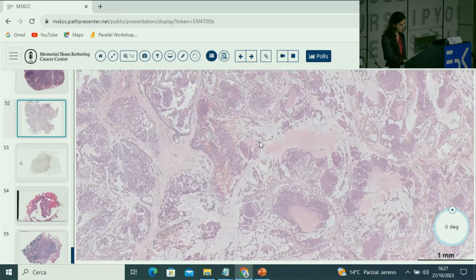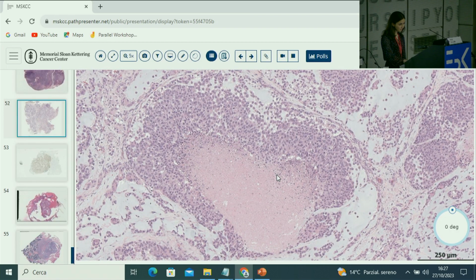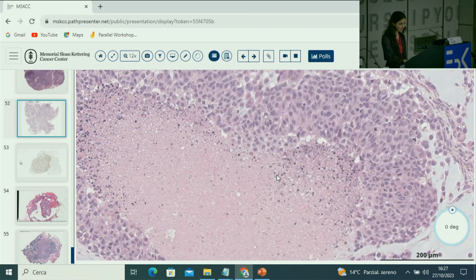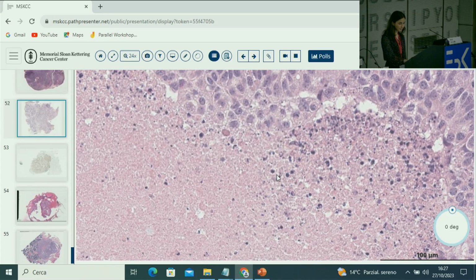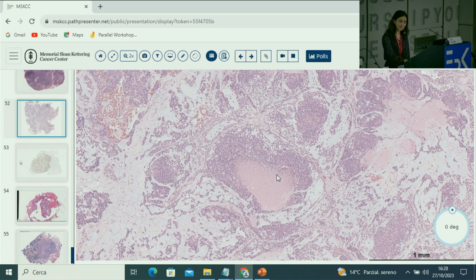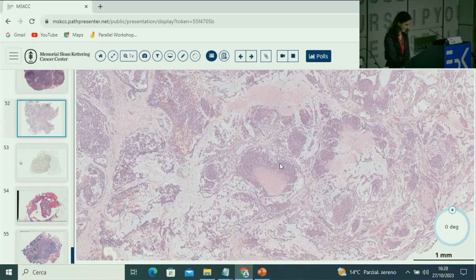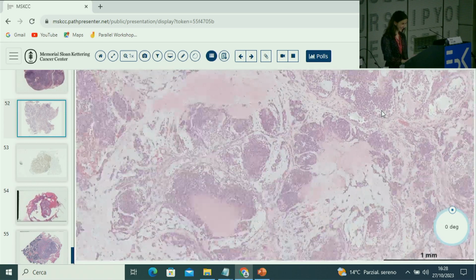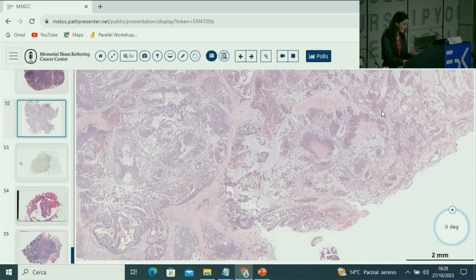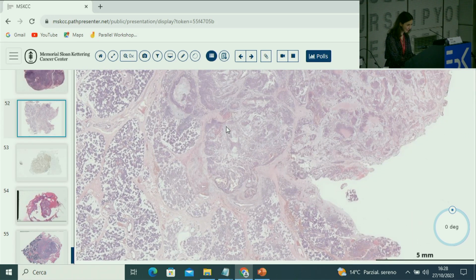This case is also difficult. It has necrosis. The cells look very pink. And I'm telling you, you should be a salivary gland pathologist. But you know, if I only have this, I wouldn't really be able to tell. But let's see if I can find the area.